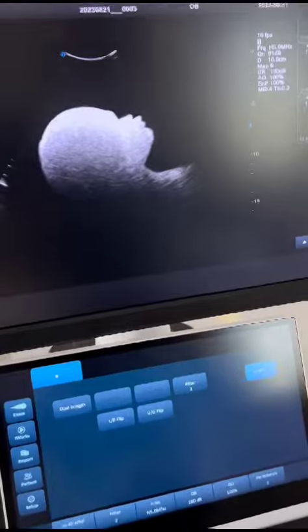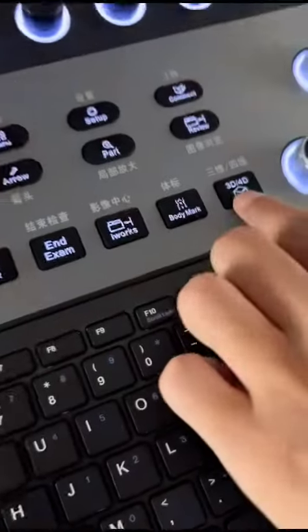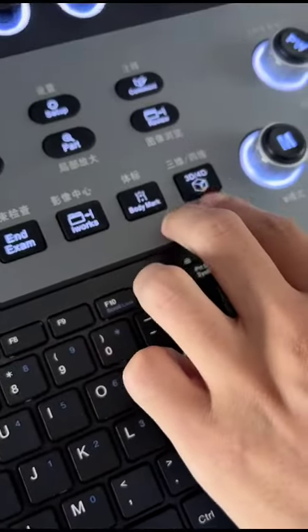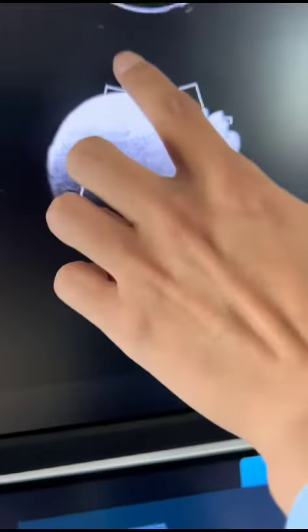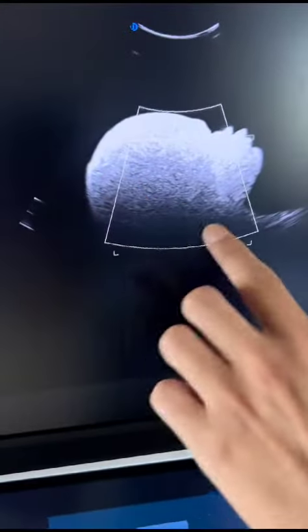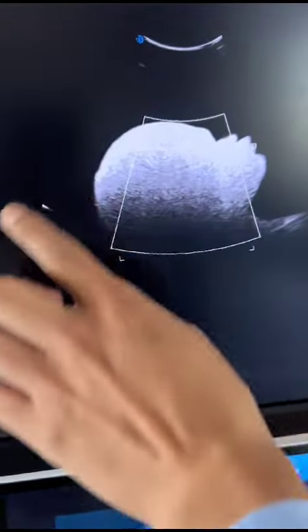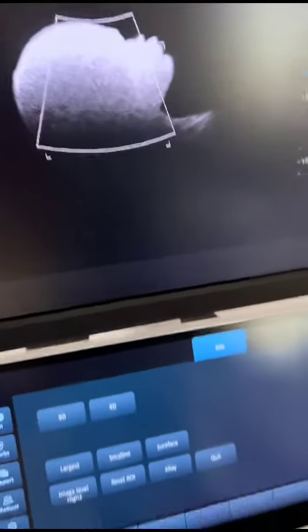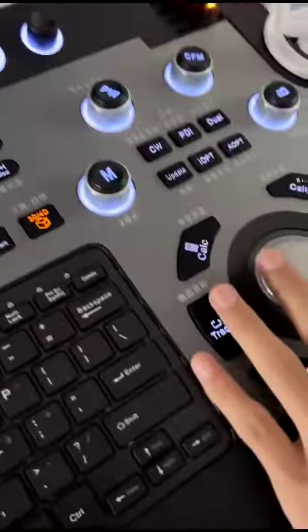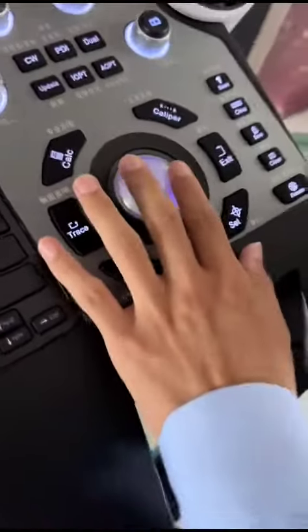Then press this key, 3D or 4D. Now please note, you need to make this sample size at the side of the working area, just like this. Move the checkbox like this.